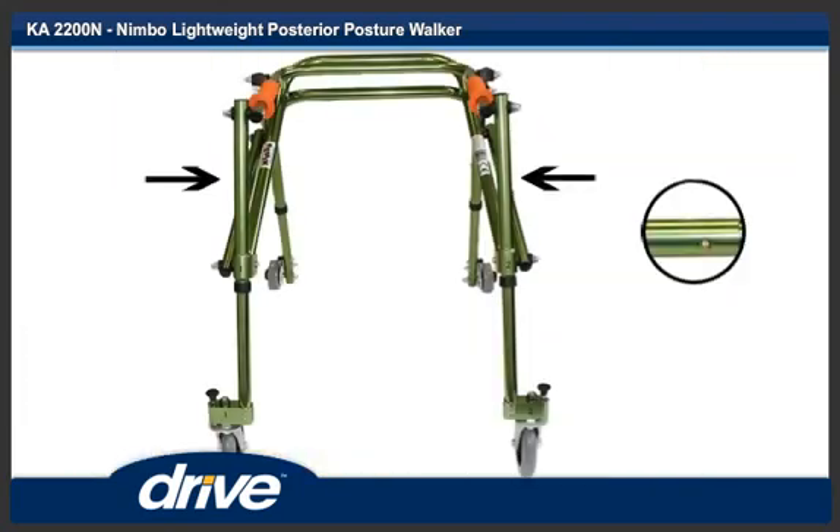Step 14. To fold the unit, push in both strut locking pins and fold the front legs towards the rear legs. Step 15.